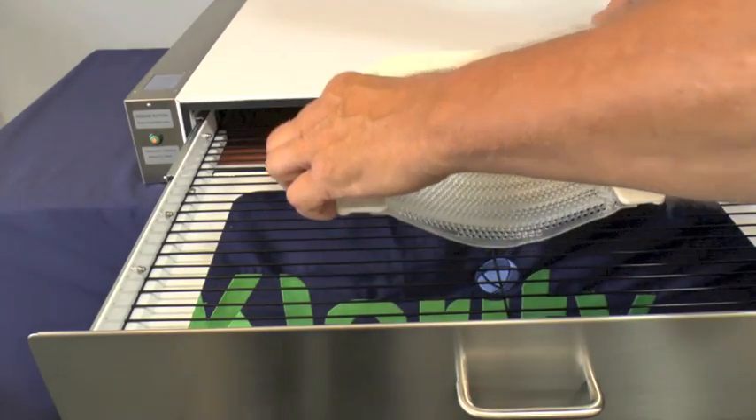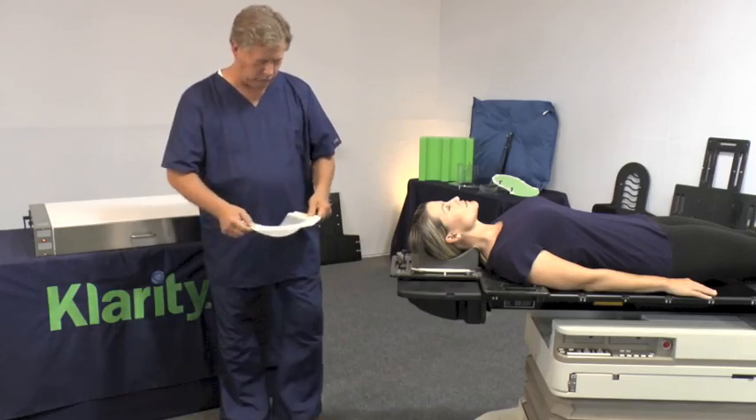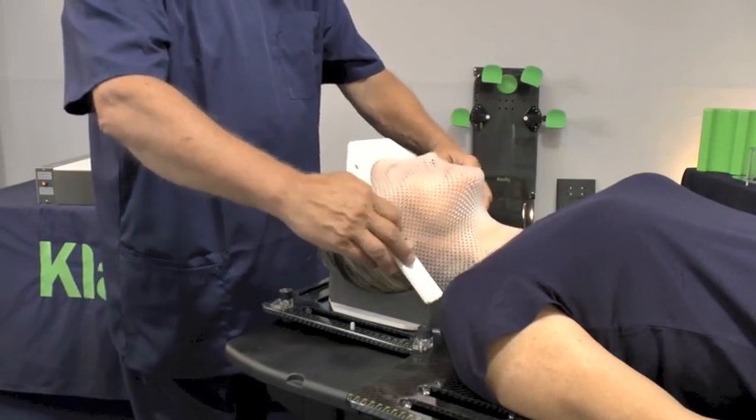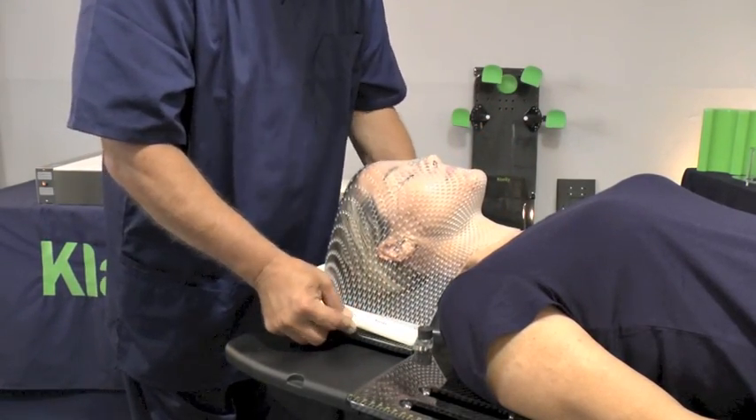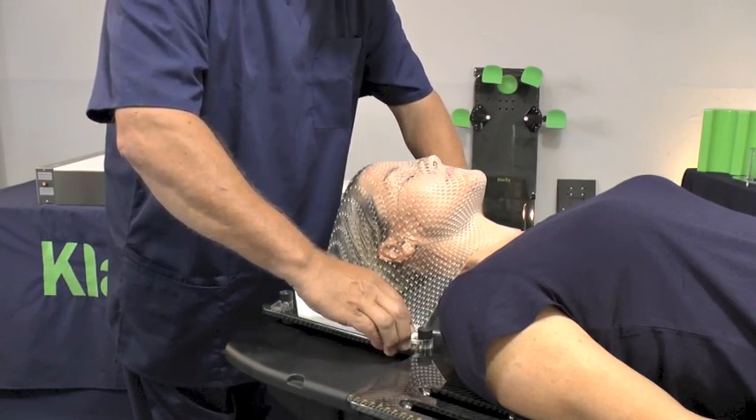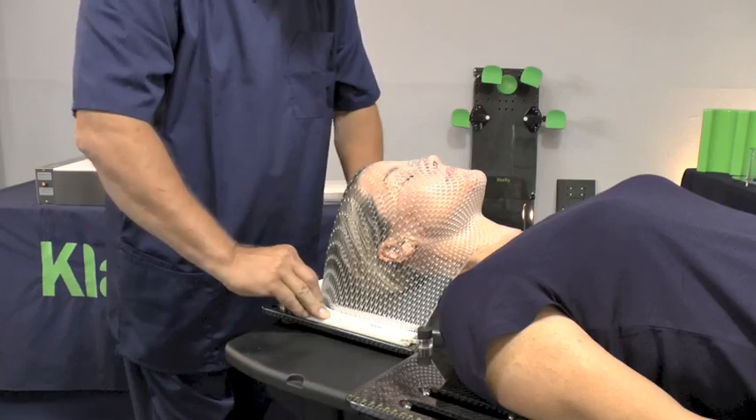With this safe, dry-heat convection oven, you can easily lift out the mask by hand and go directly to your patient. Forget needing towels for blotting off the water or having water drip on your patient.